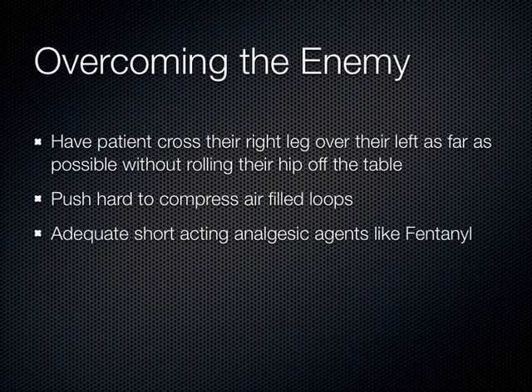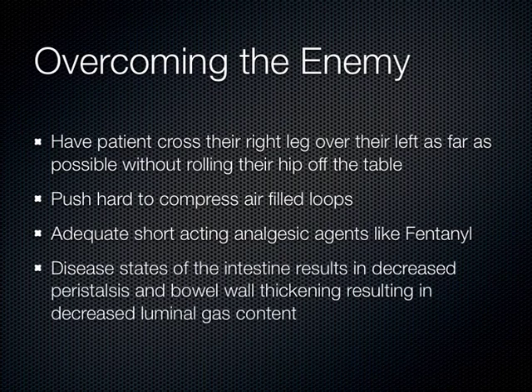You guys know what fentanyl is, a narcotic, short-acting, lasts 20 minutes. We use it a lot in patients who have acute pain in the emergency department. I can give somebody a good slug of fentanyl, and it really does take the edge off their pain so that I can compress and get into their abdomen using ultrasound. It's a much more humane way to do it than what we're going to do today to our models. But the good news is, when you have disease states of the intestine, there's less peristalsis, there's bowel wall thickening, there's less intraluminal gas, which makes abnormal intestine easier to see than normal intestine.